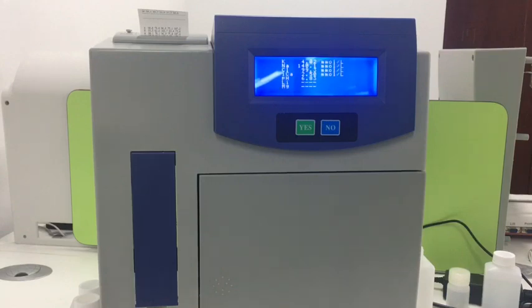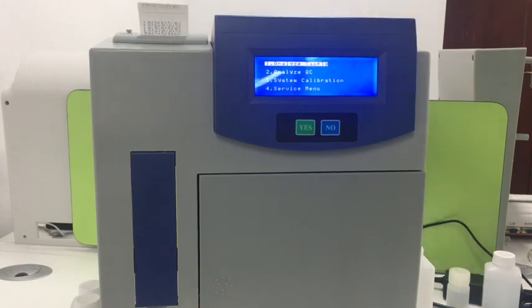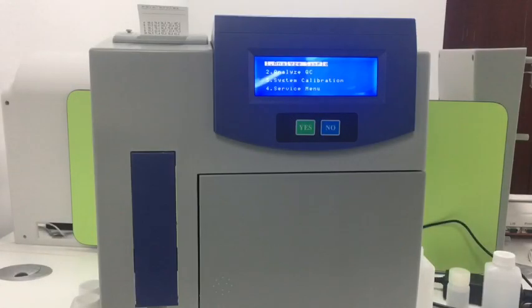Now it will show the result of solution A and print out the calibration result on paper. Then we enter into the main menu.